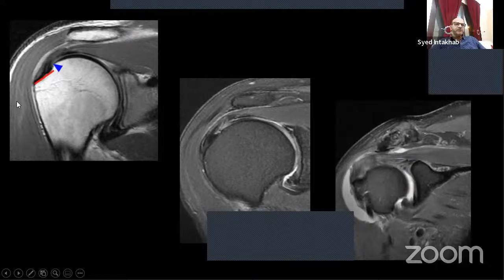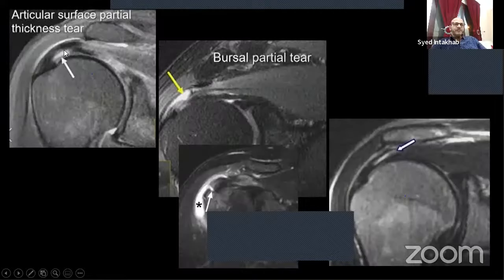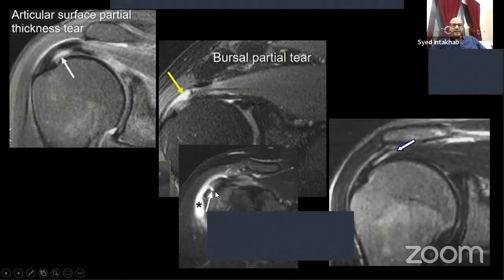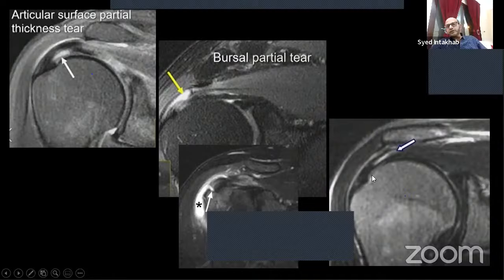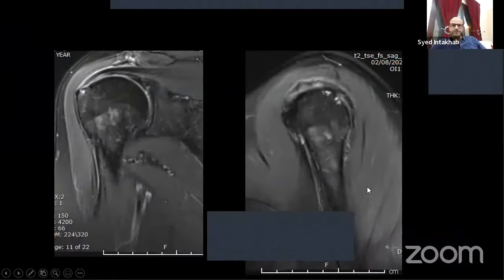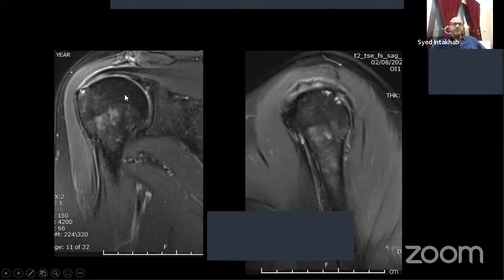Normal tendon is dark on all sequences. In tendinosis, the tendon becomes thickened with intermediate signal. Irregular margins are called fraying of the articular surface. At the footprint, any tear is called a footprint tear. Articular surface tear means the tear is on the joint side; bursal surface tear is on the bursa side. An interstitial tear is within the tendon substance and can extend to either the articular or bursal surface.